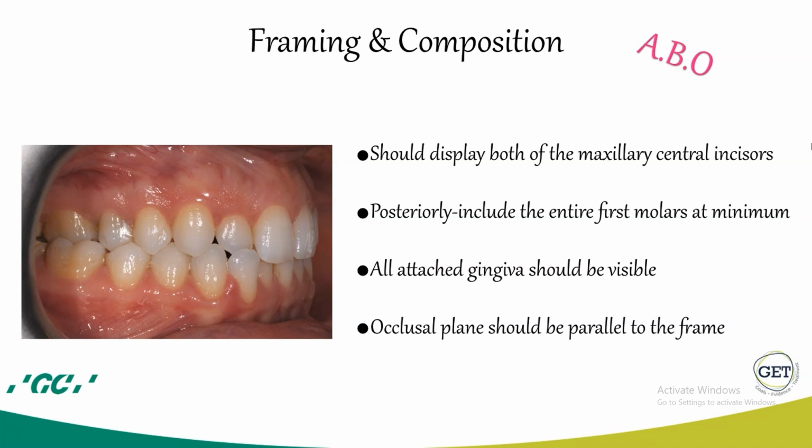Lateral intraorals should display both of the maxillary central incisors. Posteriorly, include the entire first molars at minimum. All the attached gingiva should be visible, and occlusal plane should be parallel to the frame.